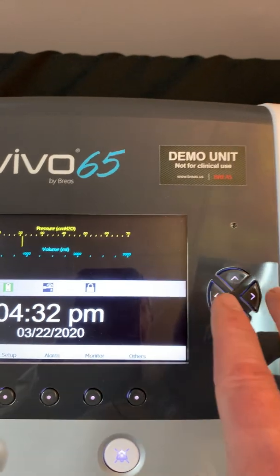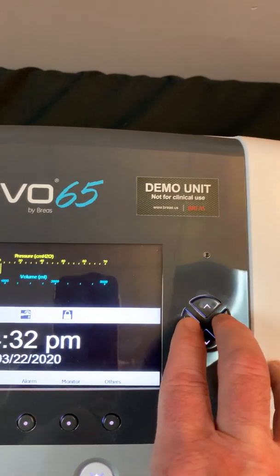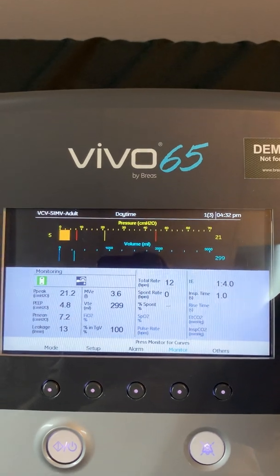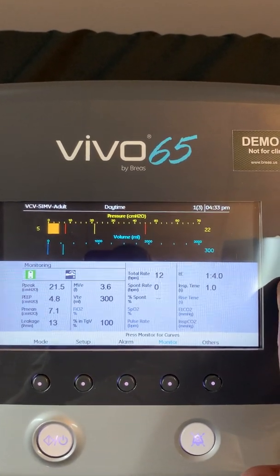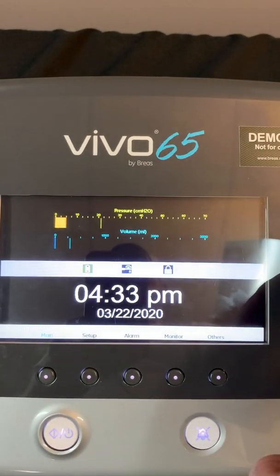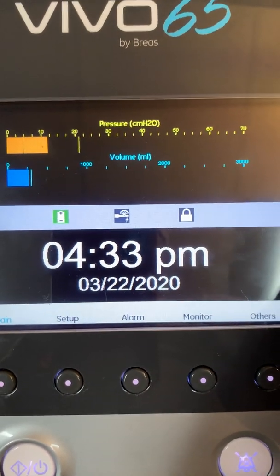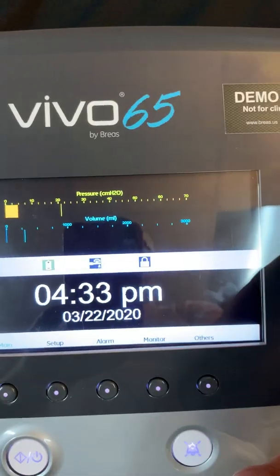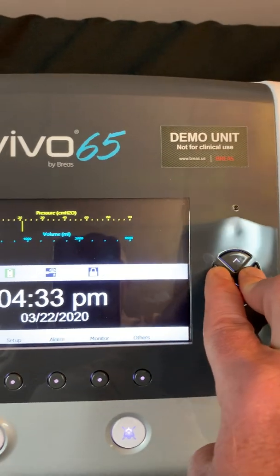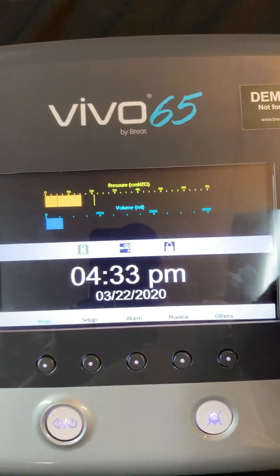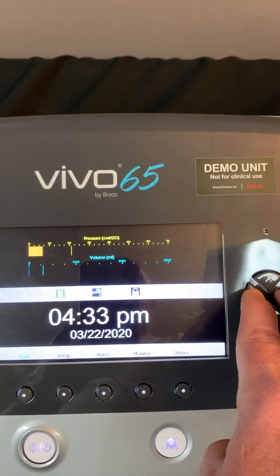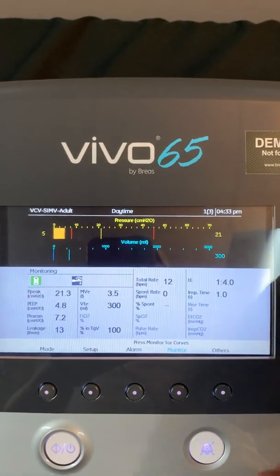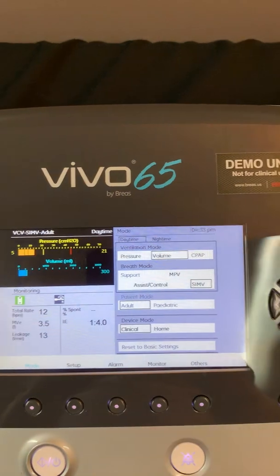To unlock the device, you're going to press the left and right keys down simultaneously. If you do that correctly, you will see a message on the screen immediately that says you are entering clinical mode. By pressing those same two keys down simultaneously, you can also enter the home mode — so you can lock and unlock the device with those two keys. If you press those two keys and you do not see anything on your screen, let go and try it again, because if you do hit them simultaneously you will see a message immediately alerting you that you have done it correctly.